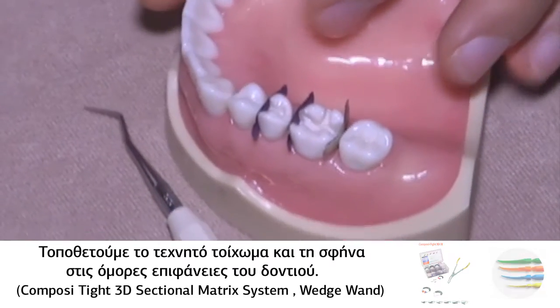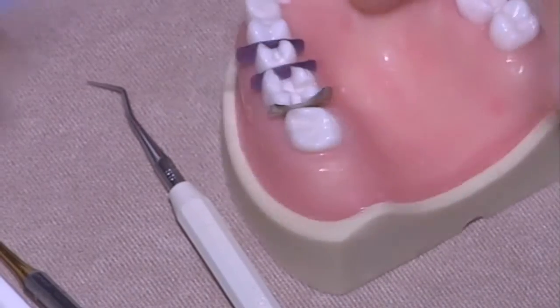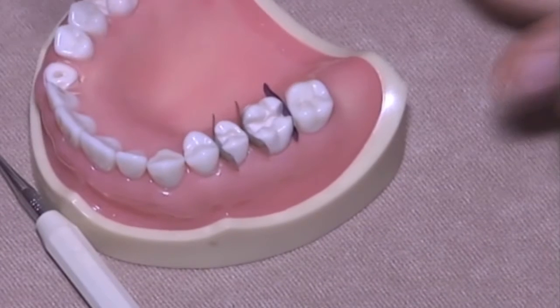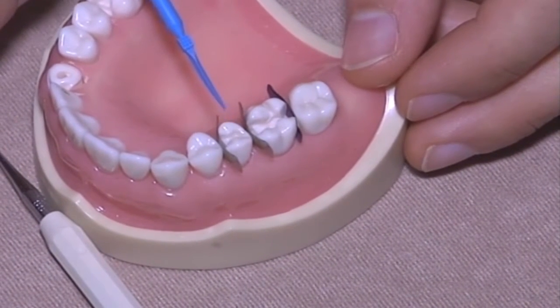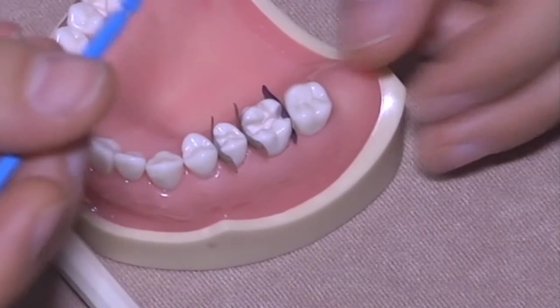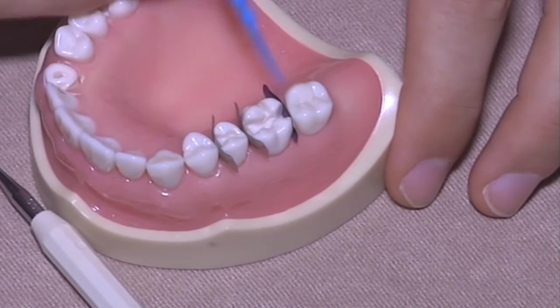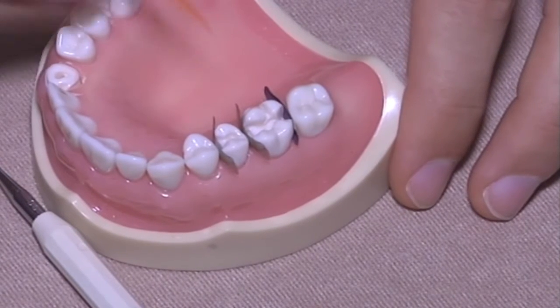So once the matrix has been positioned, you have to place the wedges. On the upper, the wedges must be placed always not from outside to inside, but on the opposite side, because on the opposite side you have a bigger triangular space here, and you have to occupy the space with your wedges.